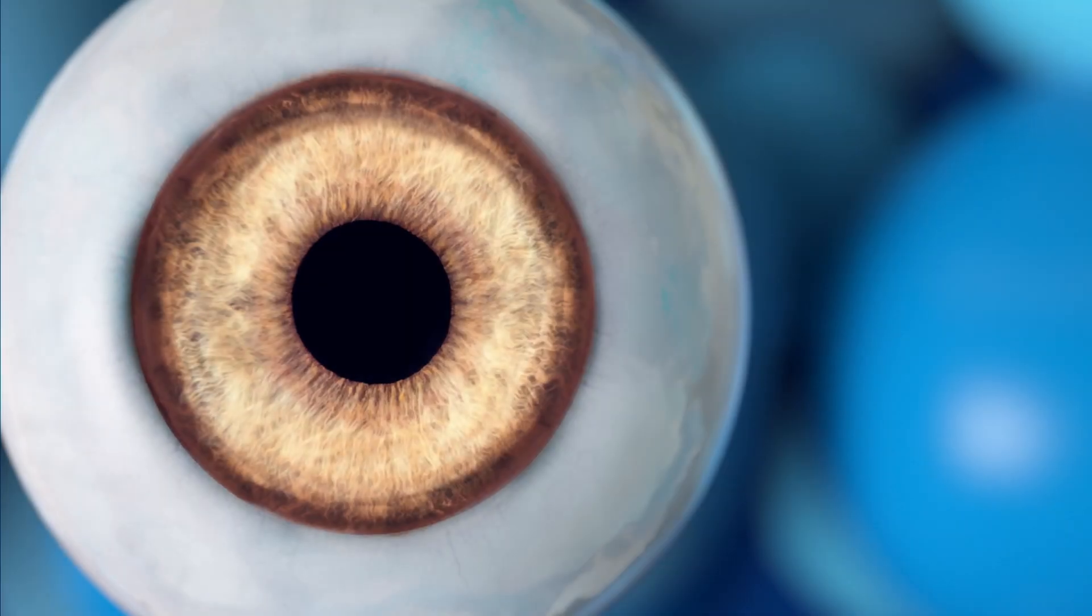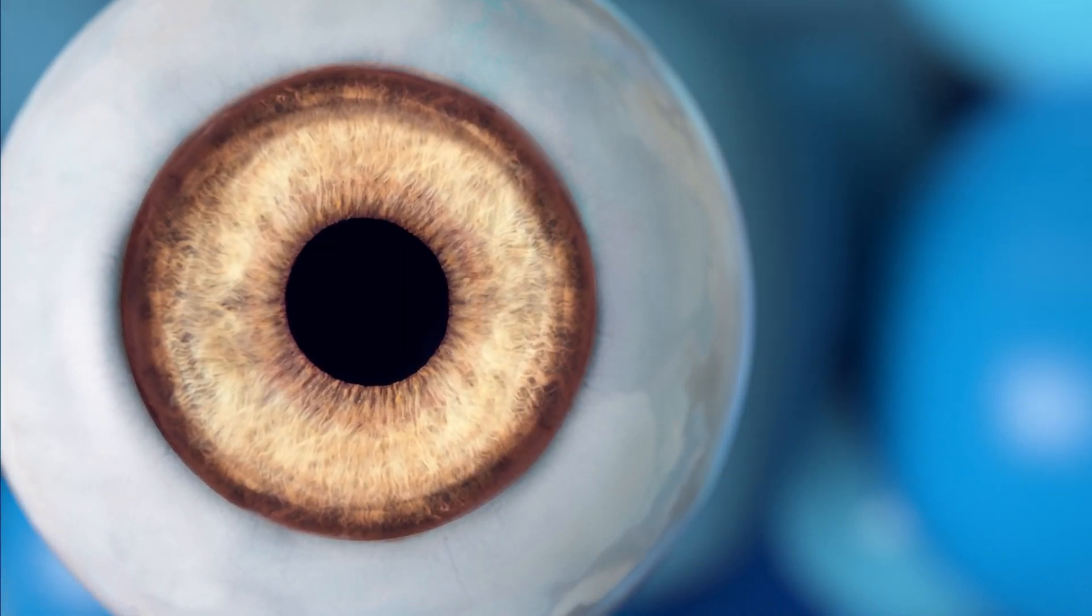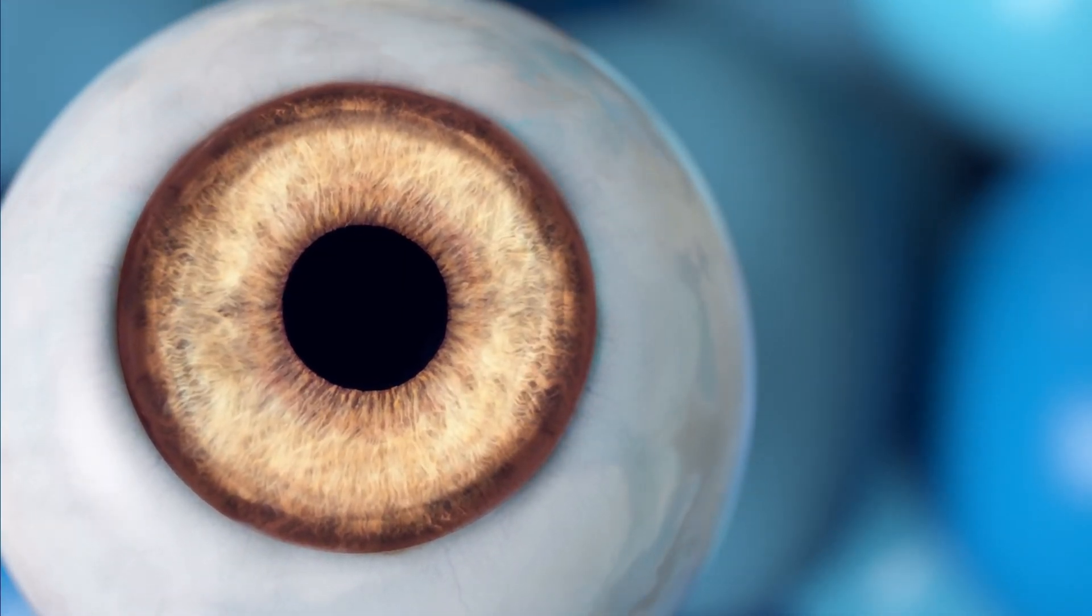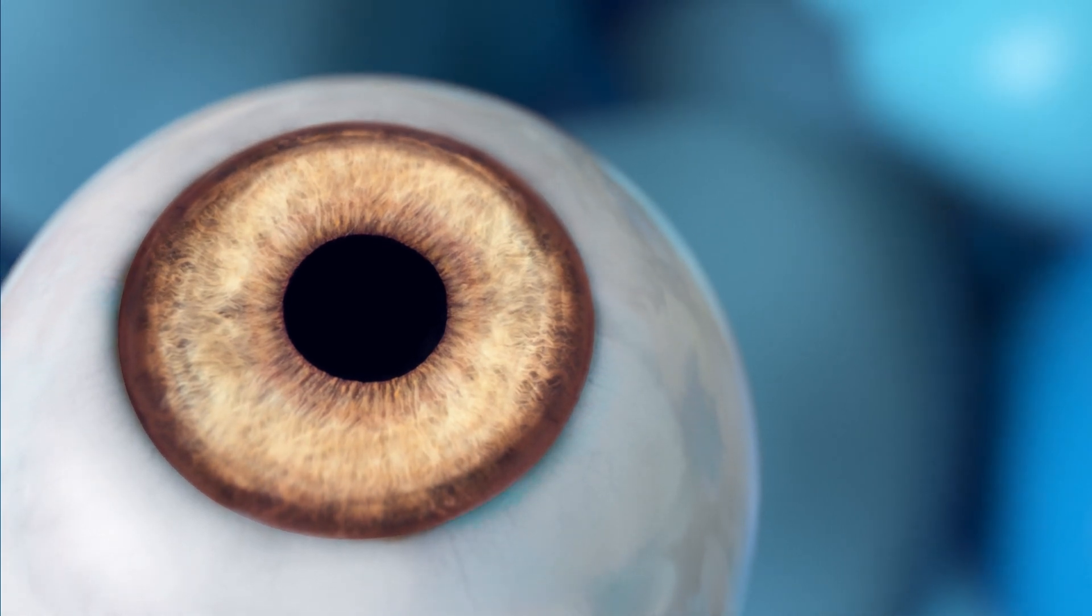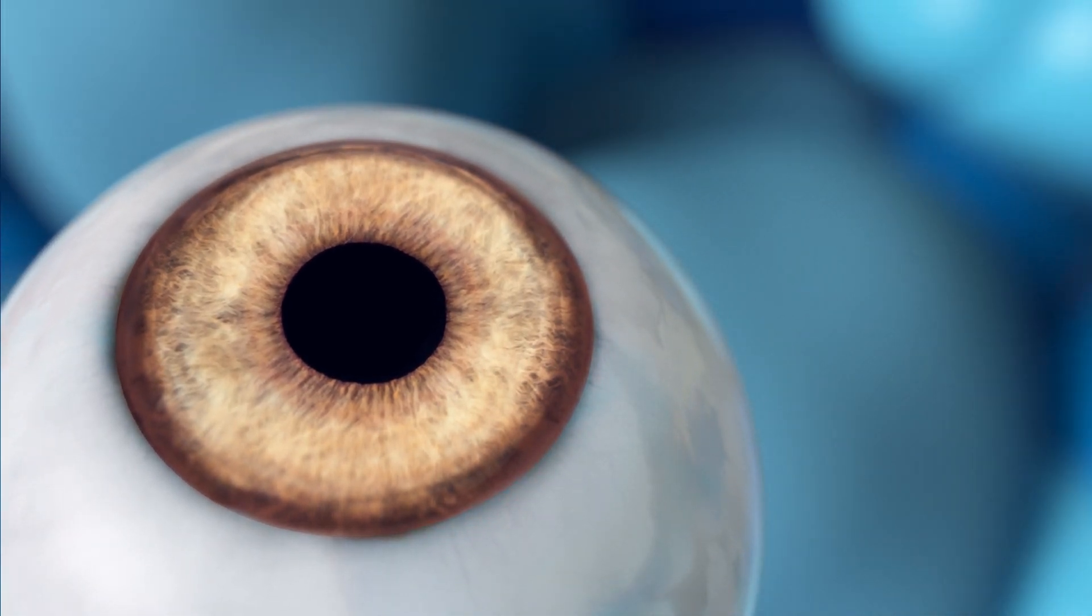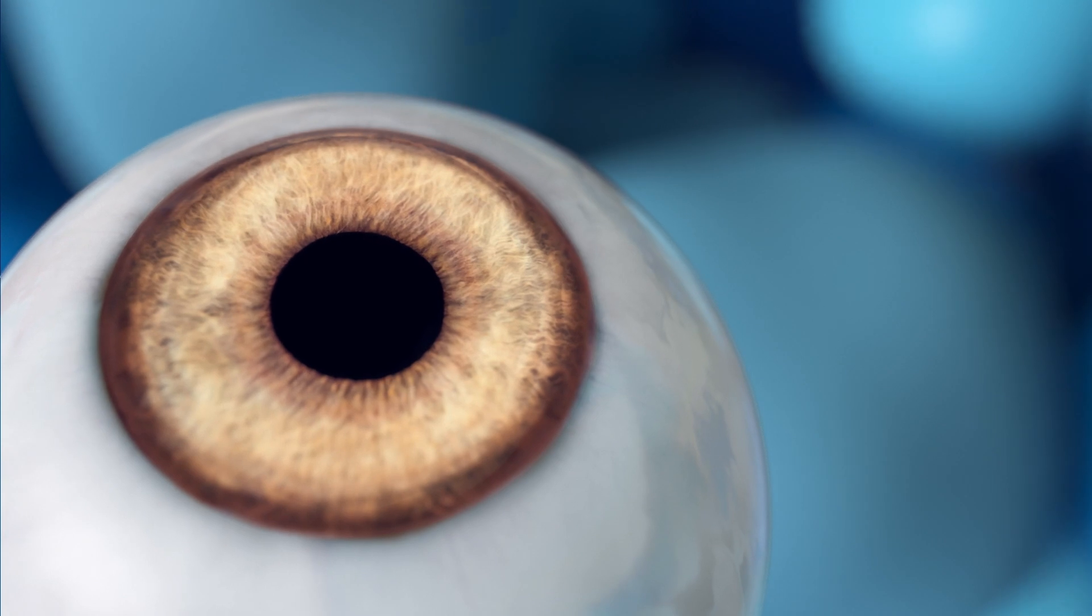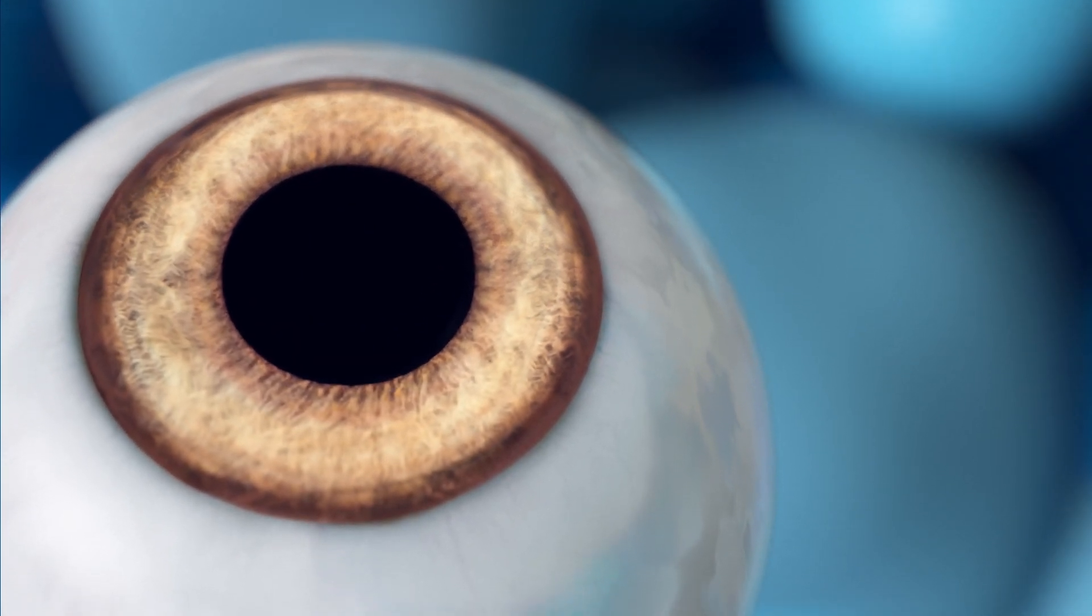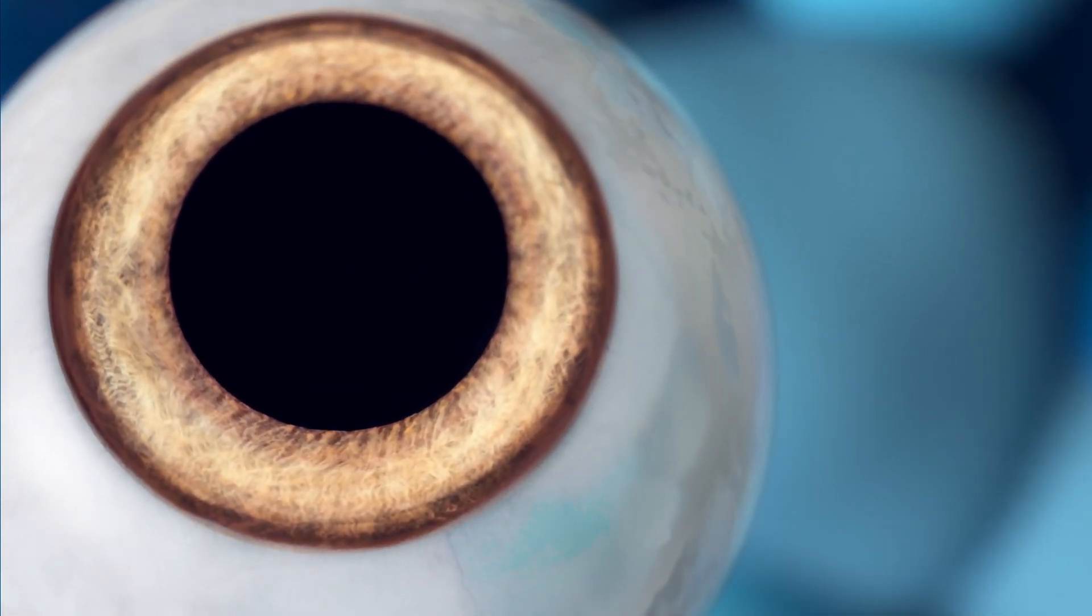Let's see how this quick and safe procedure works. Before your procedure, your doctor will perform a series of standard tests to measure the eye's unique characteristics. When you arrive for your procedure, your doctor will administer eye drops to dilate your pupil as well as anesthetize your eye.